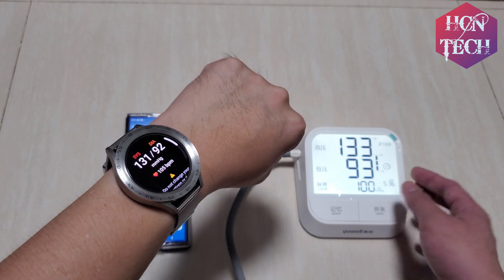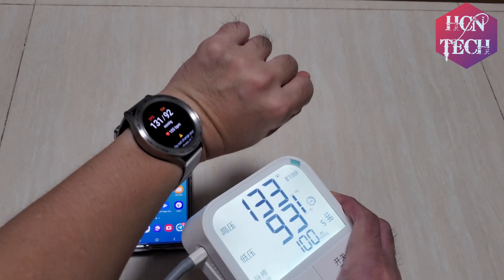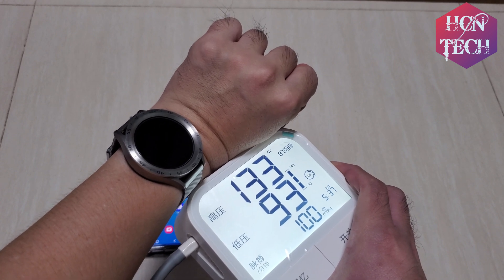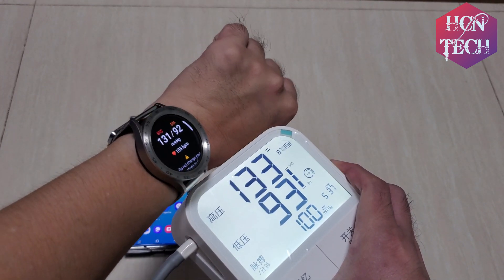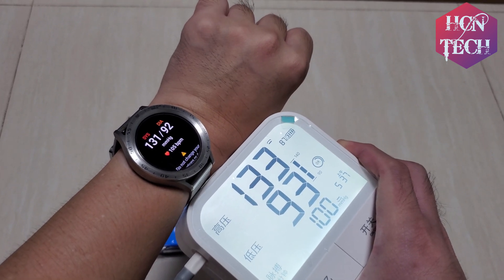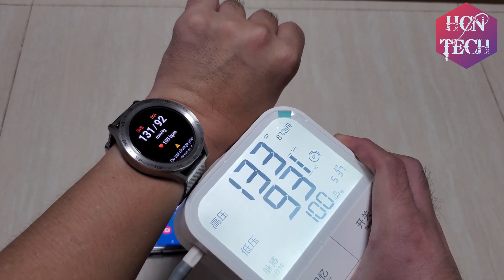As you can see, the result is very close — within one or two millimeters of mercury difference. So it looks good. Have a nice day and bye bye!